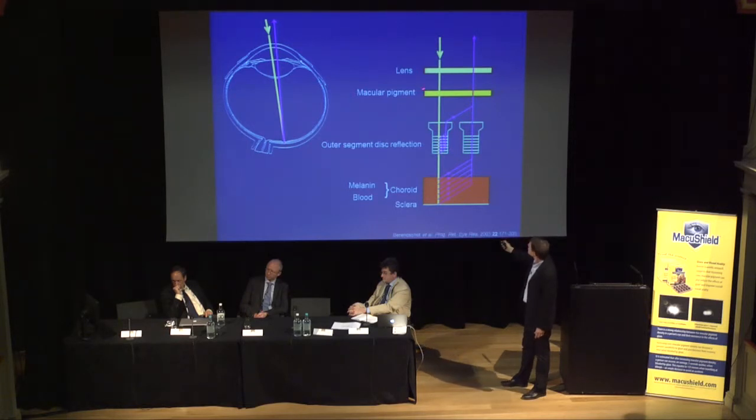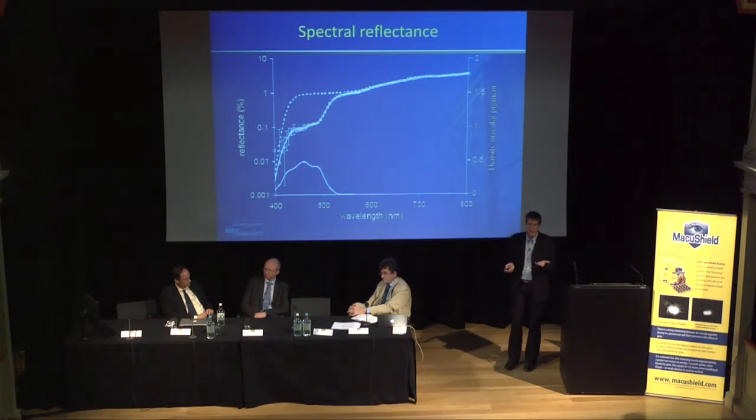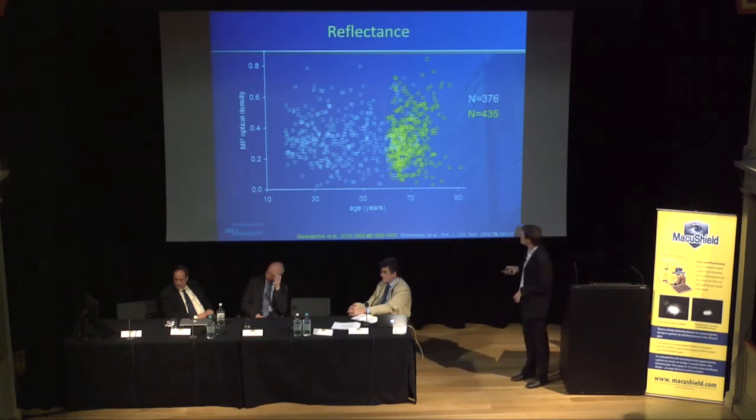Lens density is one of the parameters, macular pigment is one, and some others. But macular pigment definitely is one, and if you then look at actual measurements, these are the dots here, the squares, we can fit this straight line and have a model, a parameter, an estimate, taking into account the actual lens density, so no age estimate whatsoever, the actual lens density, and measure macular pigment density. These are examples from 2 studies we did.